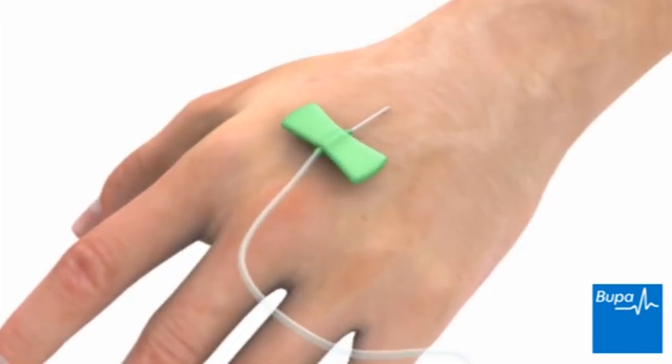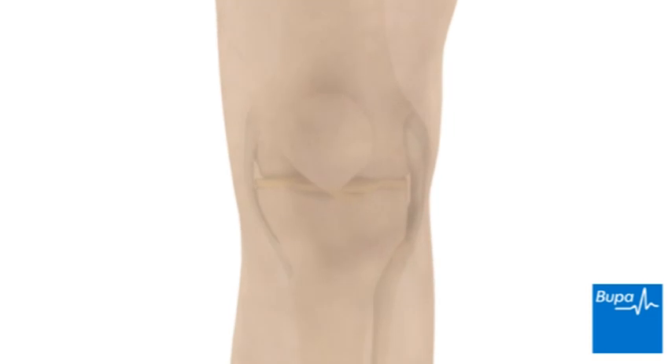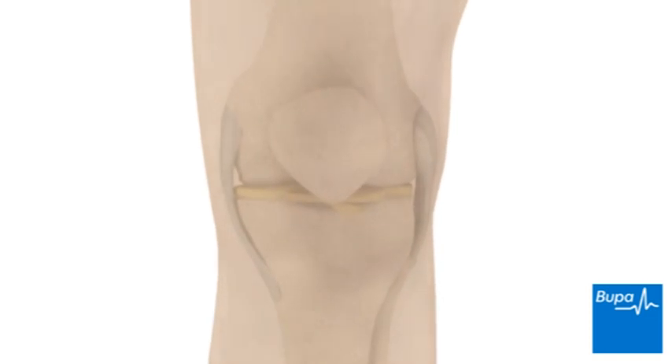You may be given a general anaesthetic, which means you'll be asleep during the operation and feel no pain. Alternatively, you may be given a regional anaesthetic, in which drugs are injected into a space around the spinal cord, or a local anaesthetic. Both block feeling in the knee area and will allow you to stay awake during the operation.